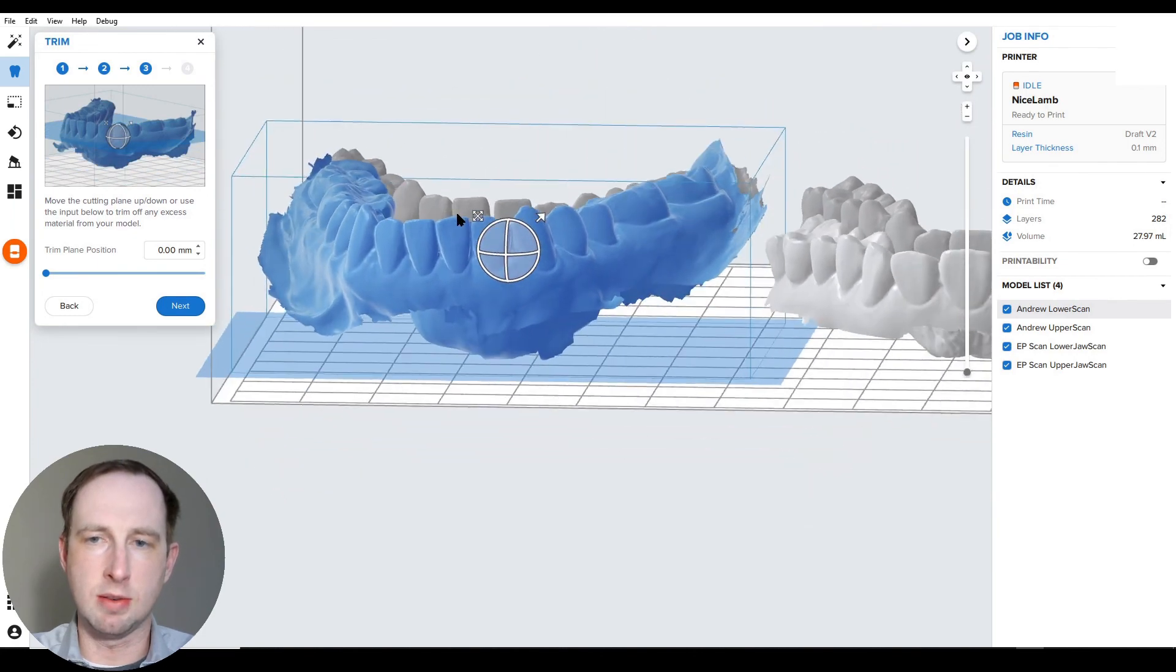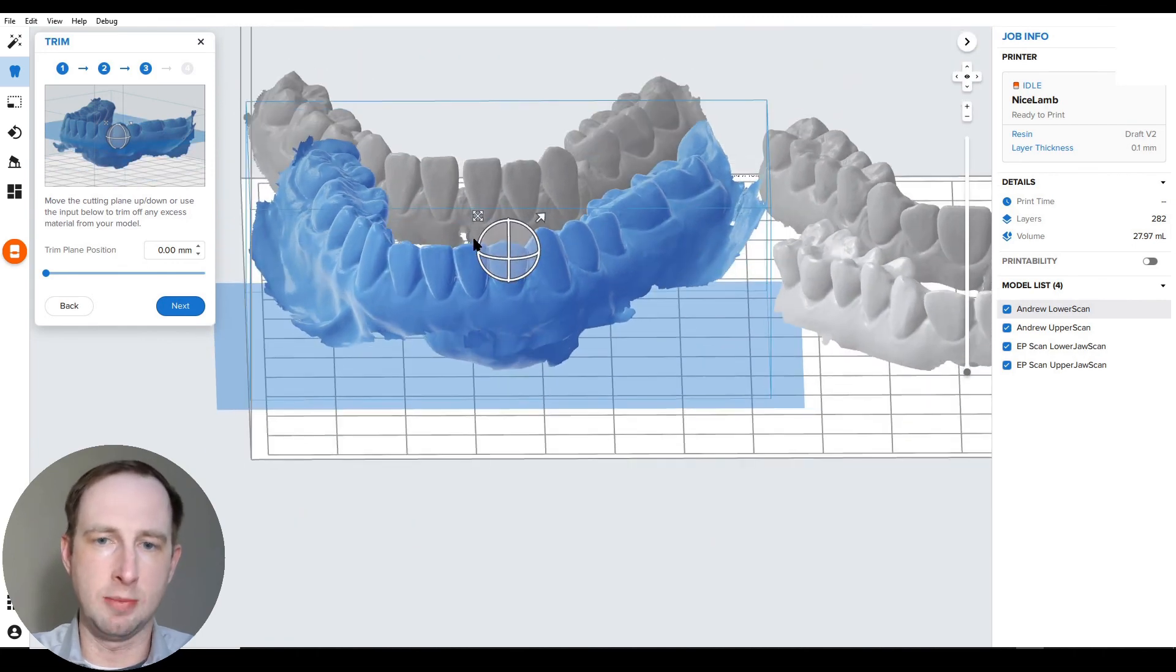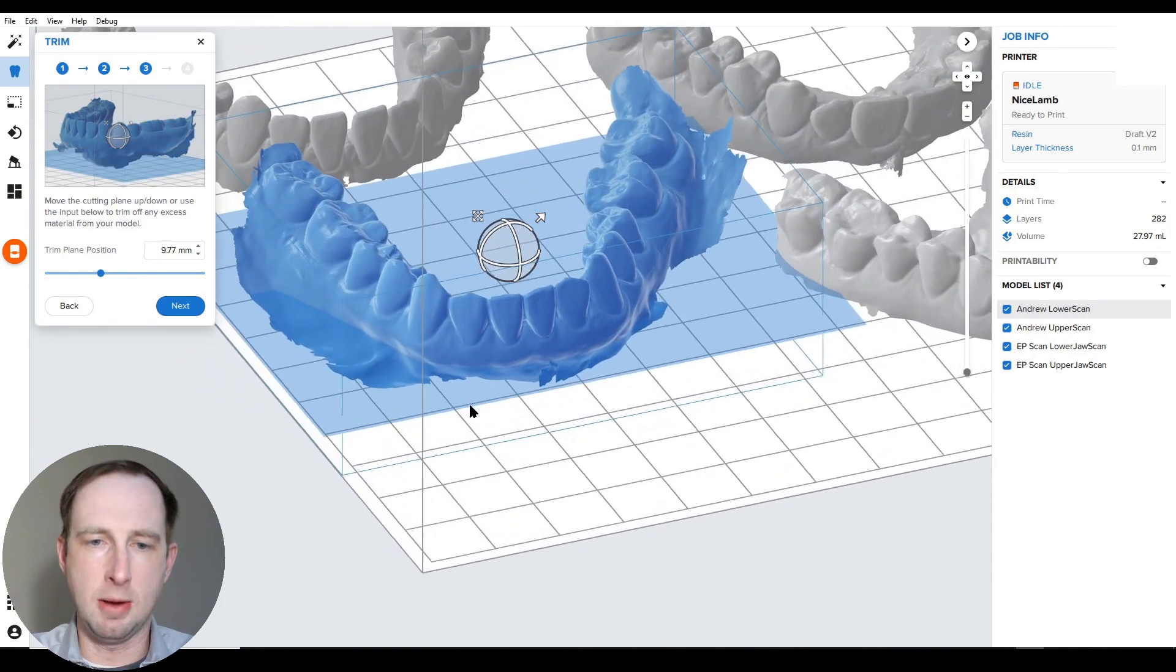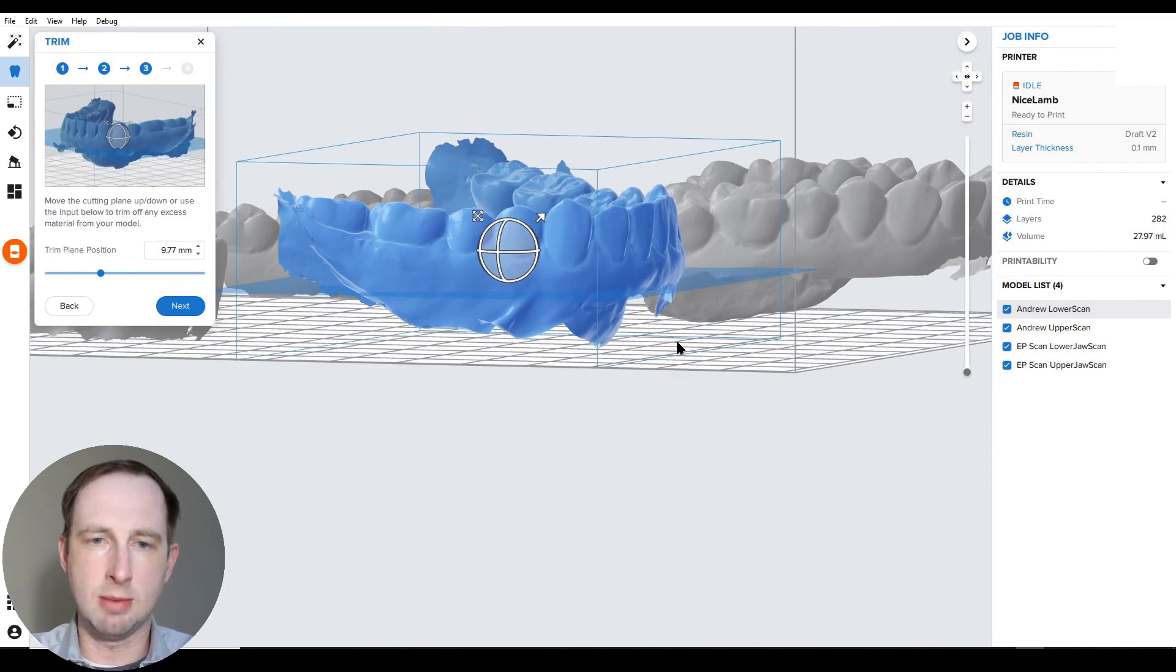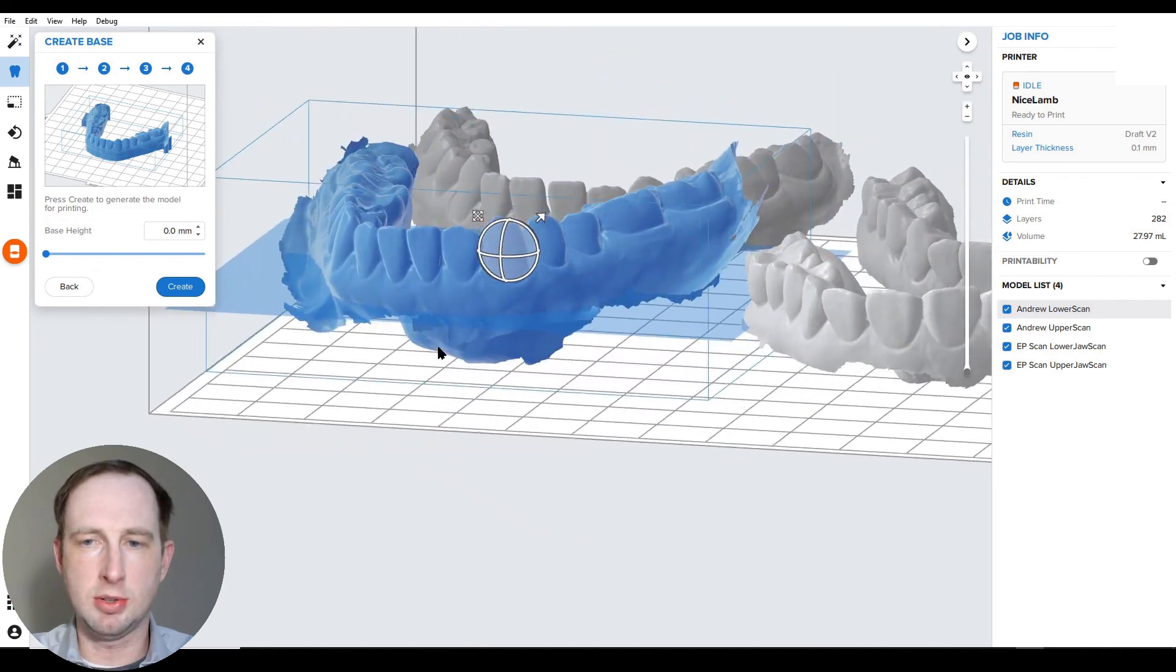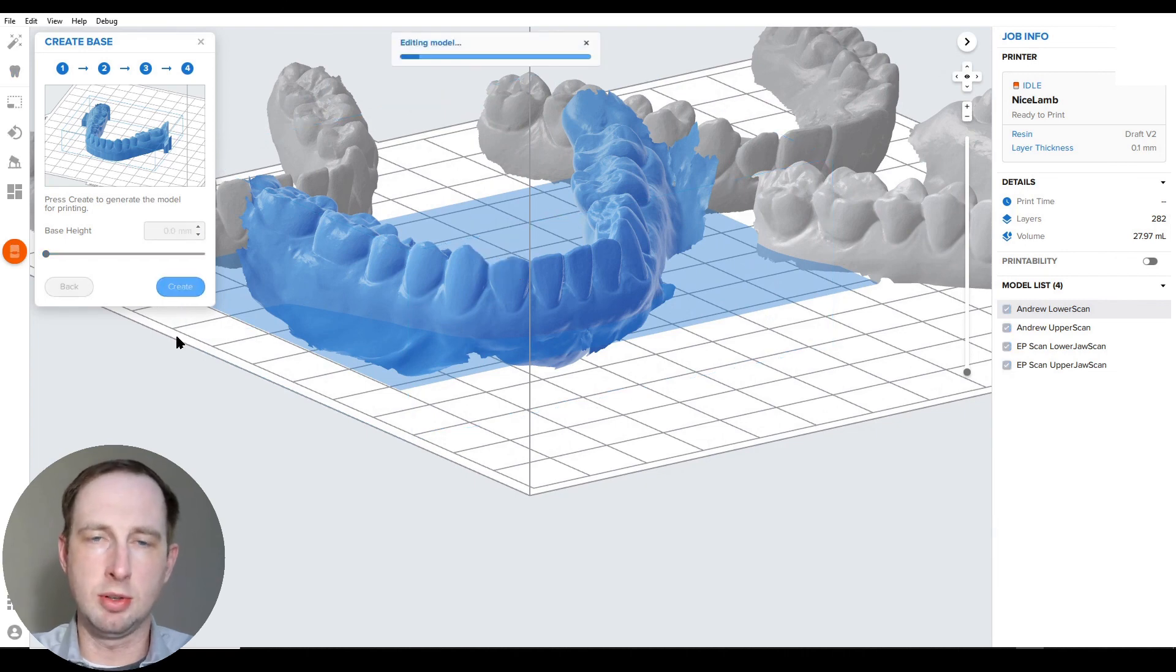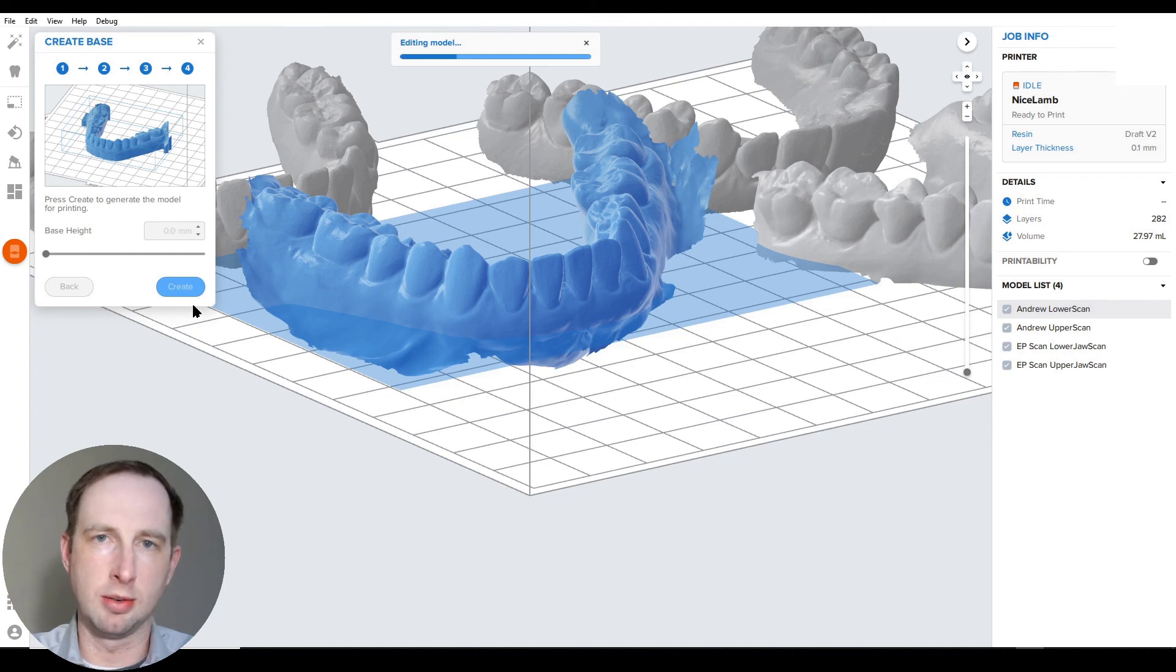This is the neat part. Once you set this, like if these are all generally the same height scans, and if you're taking the digital impression, you can generally capture more or less the same. If they're all generally the same height, say you set this pretty conservatively like the trimming plane like this, you can apply that to all these models moving forward. Generally, these are all around the same height. Maybe this one's a little bit lower, but get a good general guess. You hit next. This is going to be a pretty tall model cut like this, so I'm going to do base height zero and you hit create. So I'm going to edit some of these calculation parts.